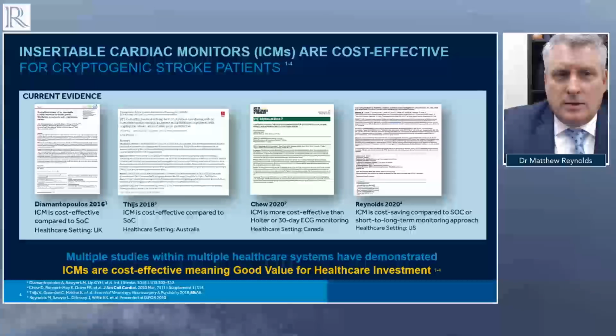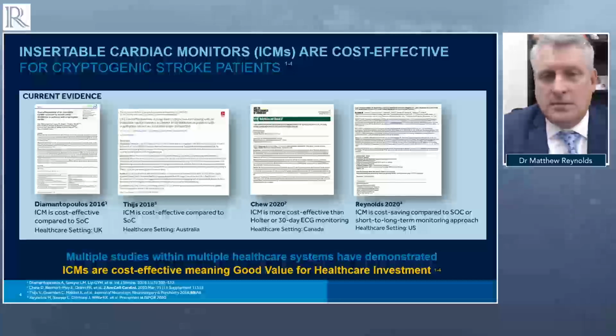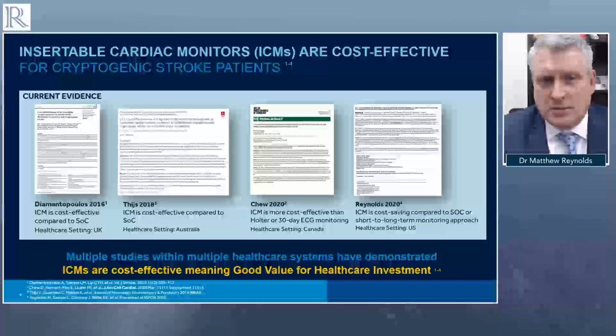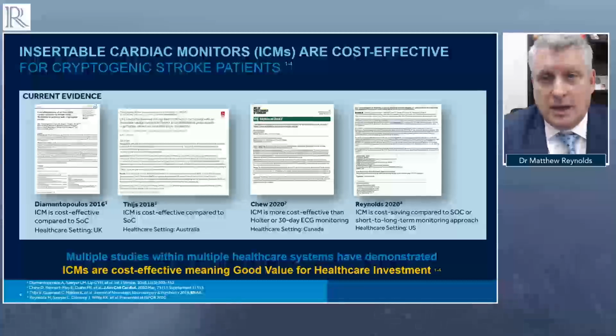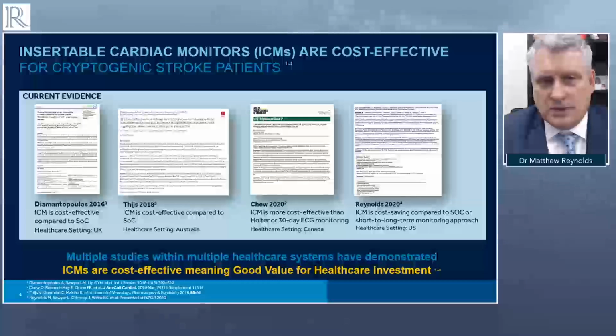So what do we know about the cost effectiveness of insertable cardiac monitors for cryptogenic stroke? Well, we can look to the academic literature, and Dr. Witte and I have contributed to this. At this point, there's one published, peer-reviewed manuscript, specifically using data related to the LINQ device for patients with cryptogenic stroke. This was a paper that we published in 2016. It was done from a UK perspective. And we did, in fact, conclude that the LINQ was cost-effective for this clinical indication.